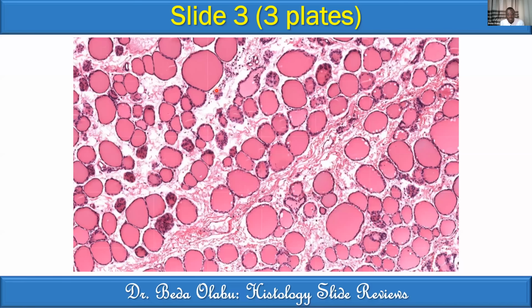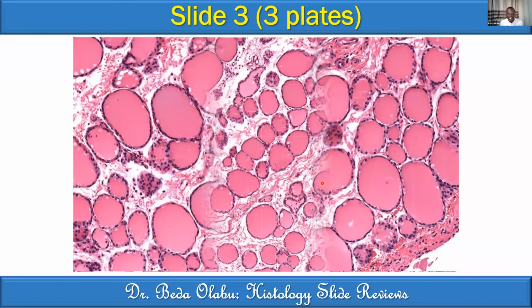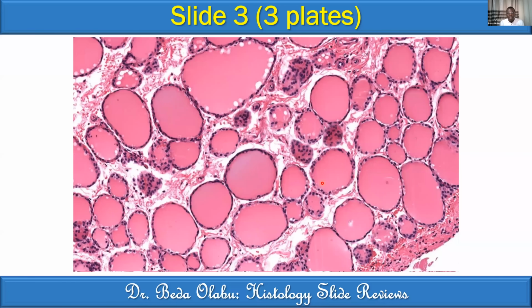And we are confirming that the follicles consist of a ring of cells. We are not able to determine the shape at this magnification, but that ring of cells surrounds a central homogeneous material. Homogeneous here means uniform material. The other things you've already captured, so let me not repeat them. Then at this last magnification, there are two additions I want you to pick.